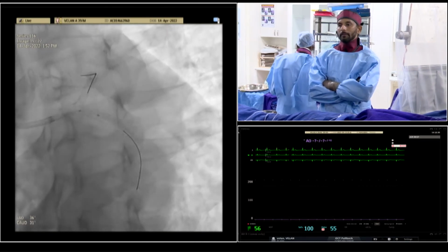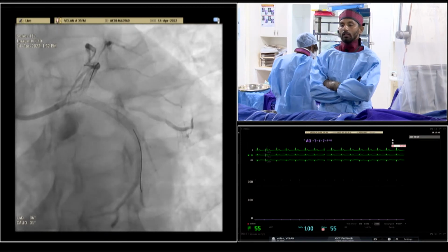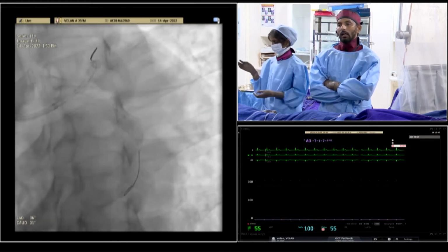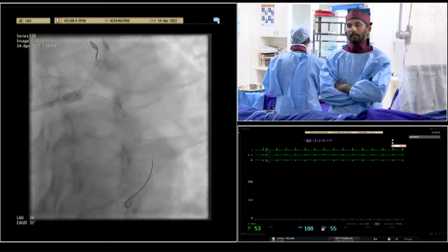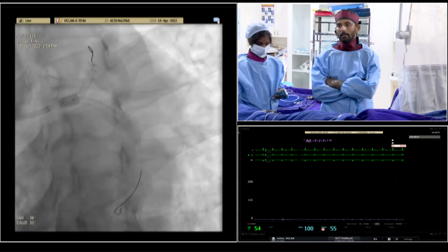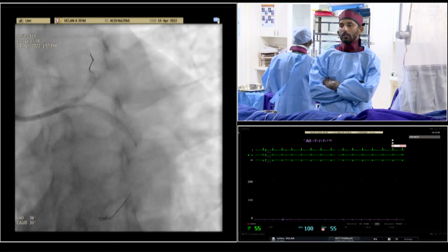Next one. So this is just to take StentBoost pictures, and this is the shot after doing the second kissing inflation. And then we want to do a re-POT after the second inflation. This is again with a 5 millimeter NC balloon. At this time I went up to 14 atmospheres with a 5 millimeter NC balloon. Next one. And then we decided to do an OCT run.